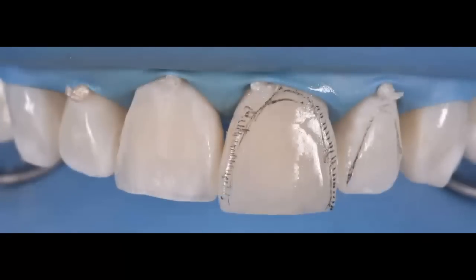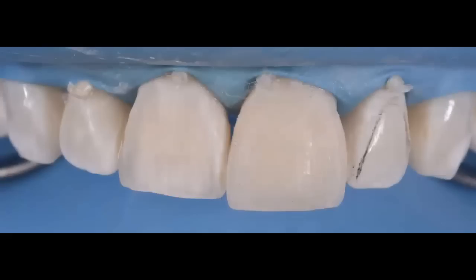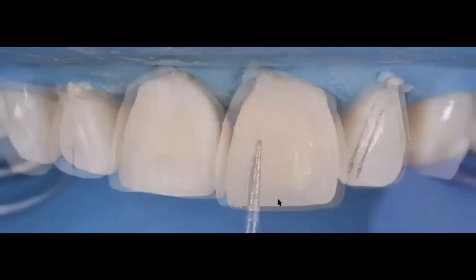I'm drawing exactly where I want my line angles. What are the areas that are going to be affected by my disc? What are the areas that are going to be non-affected by my disc, so that I can keep that ideal mesial distal width? And you can see here, this is what I call the pre-finishing. Now all I have to do is try to duplicate this same shape on tooth number 8. So this is the reason why I like doing one tooth at a time.